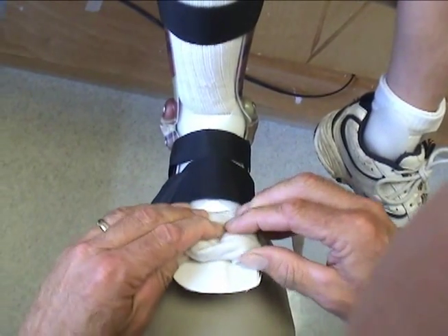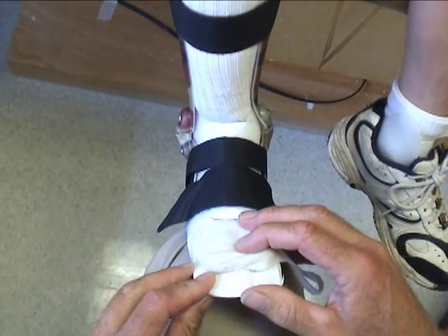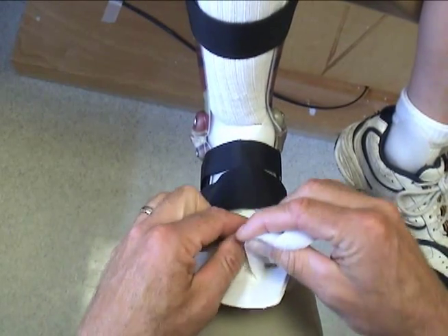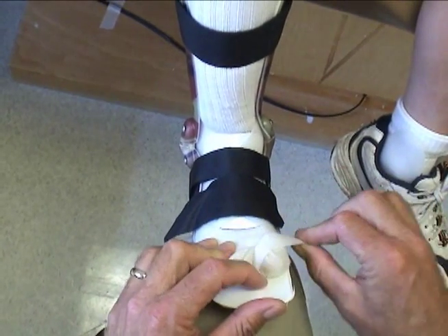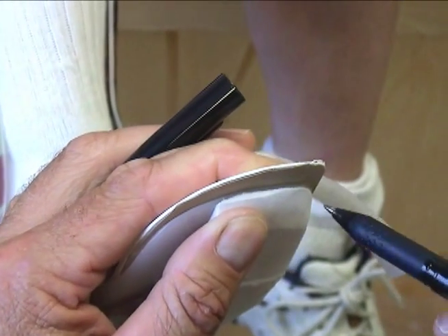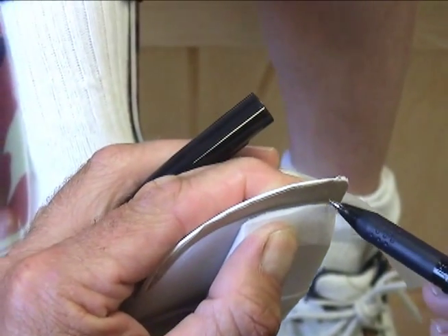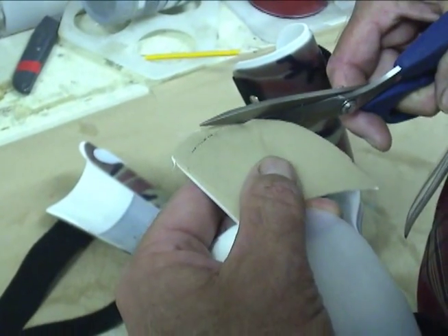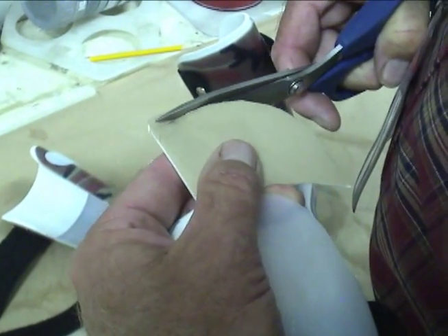This fit looks good. The toe strap that we see in this video is an optimization used to help control forefoot abduction. After placing the toe rise, I do an overall length adjustment. Expect approximately one half of an inch of growth room when the patient is standing.